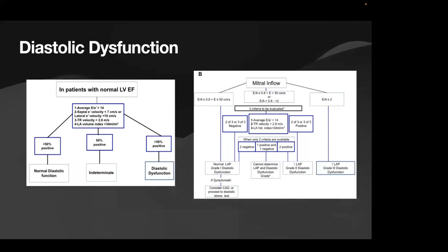Whereas it starts to become much more challenging when your S and your D ratios become similar, your S becomes blunted. There are a lot of parameters that can affect that, because it's not only the stiffness of your left atrial and your left atrial filling, it has to do with volume, driving pressures, and any other valvular dysfunction. And then we're not even going to get to the point of talking about how high left atrial pressures can affect the pulmonary vascular resistance, which is another thing. But I agree, Kathy.